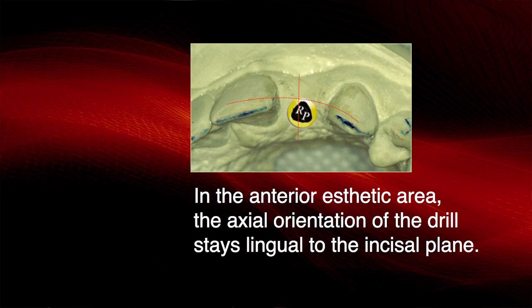If you're making a surgical guide, you can do this on a model, and the next few slides will illustrate that. So we have ideal placement away from the facial bone. If it's too far facial, then you have a chance to get an avascular necrosis, which means that the tissue and the bone is going to resorb and the patient's going to show metal. There'll be threads showing. So placing it more to the palate, you're going to avoid that problem.